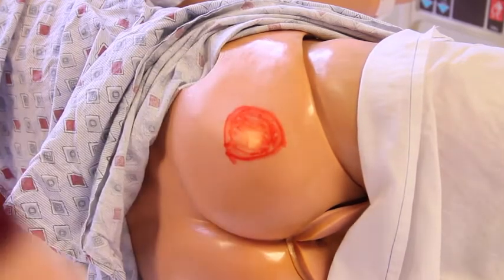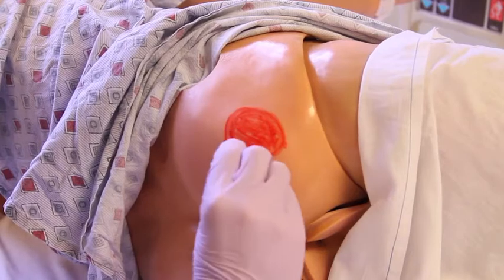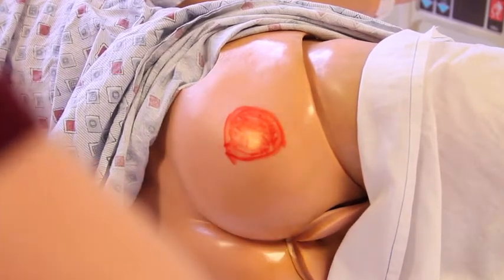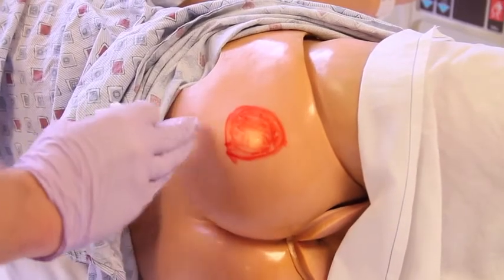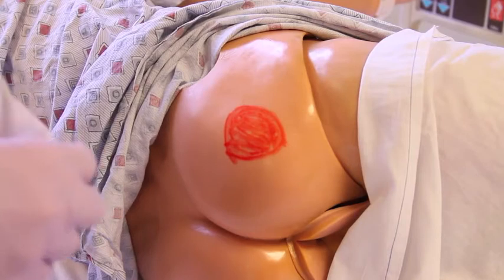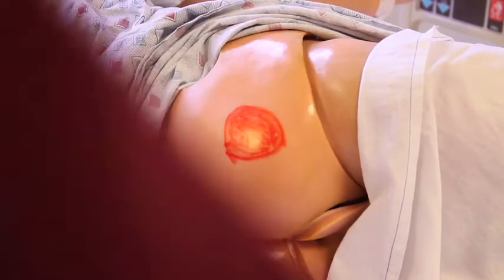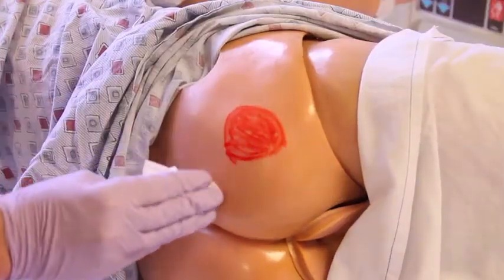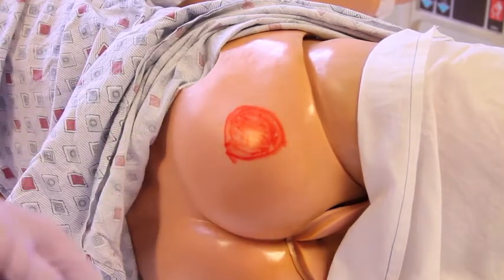Wipe away. And wipe away, and continue that until you have thoroughly cleaned the wound. And after you do that, you're going to apply a new set of gauze. Before you do that, if you'd like, you can grab dry gauze and just dry the excess water, because you want to prevent as much skin breakdown as possible.